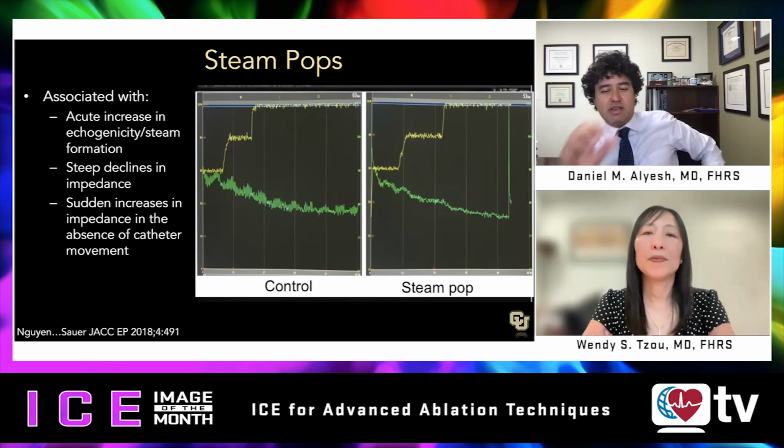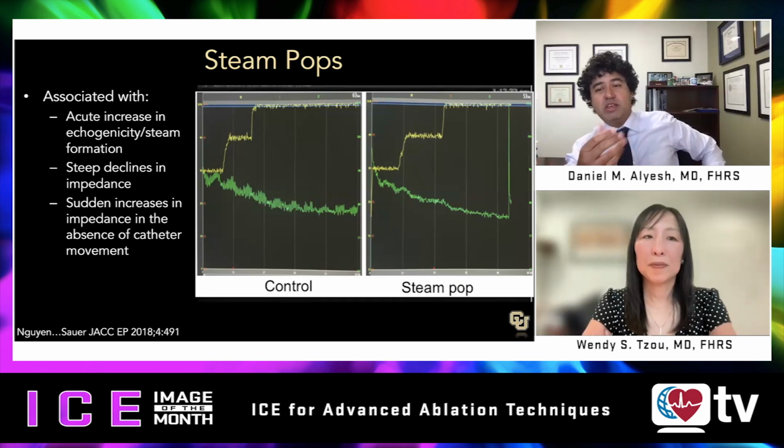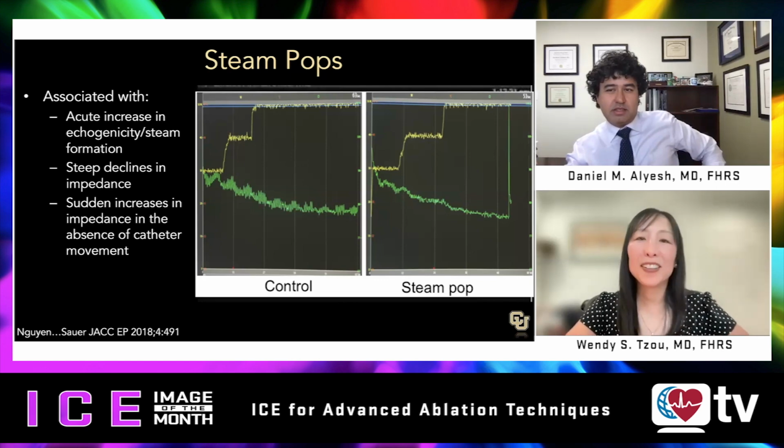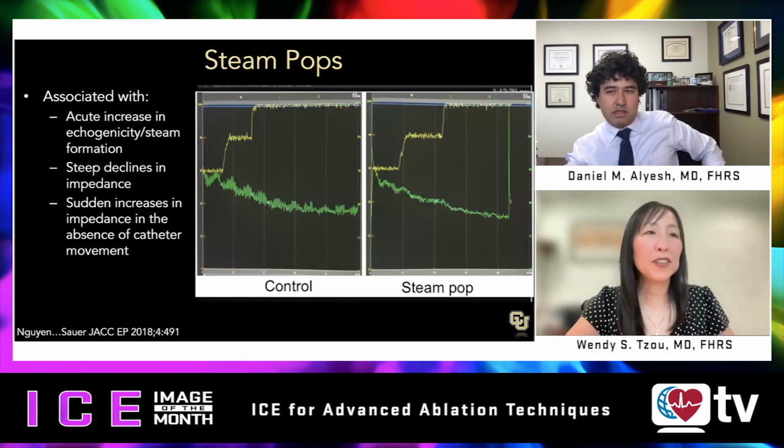So a nice example of that, and also a nice illustration, in a more scientific way, of how you can use all these tools to avoid steam pops. So thank you. No problem. I agree with you. I think as PFA is introduced increasingly in clinical use, it'll be interesting to see. I think ice will still be important. It will be interesting to see what sort of signs of efficacy and safety might develop with use of that energy source.